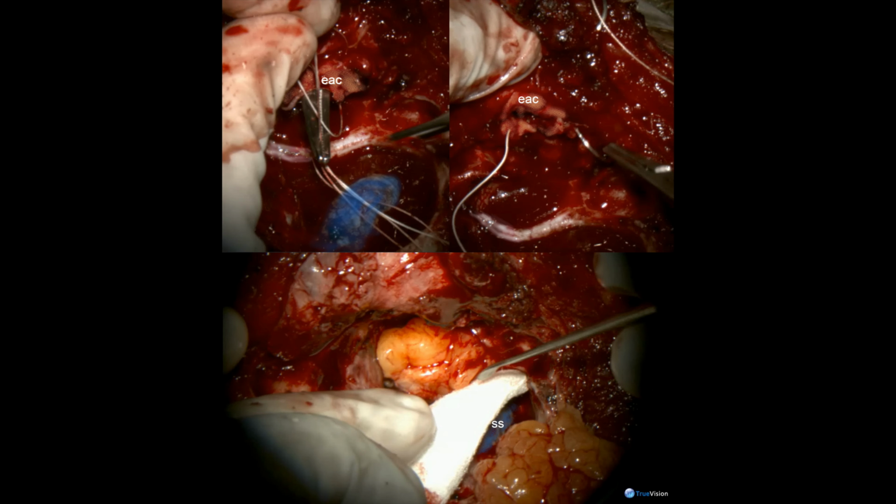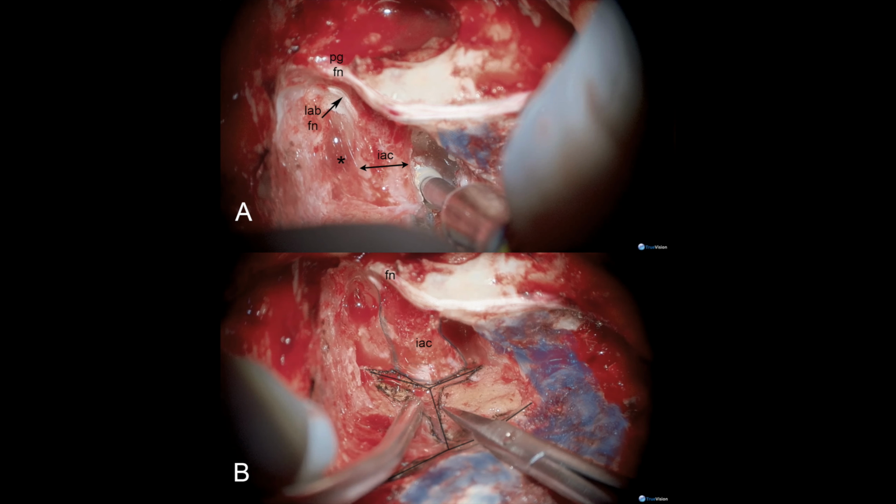This technique evolved from the older transotic approach, but in our version, the cochlea is preserved. Preserving the cochlea maintains facial nerve blood supply, and by avoiding early dissection near the stylomastoid foramen, we protect the stylomastoid artery. For this reason, postoperative facial nerve weakness from the approach itself is exceedingly rare. Now we move to the second phase of the operation.